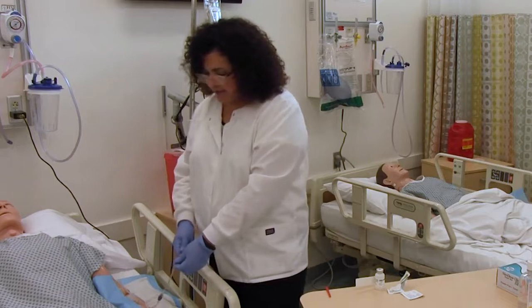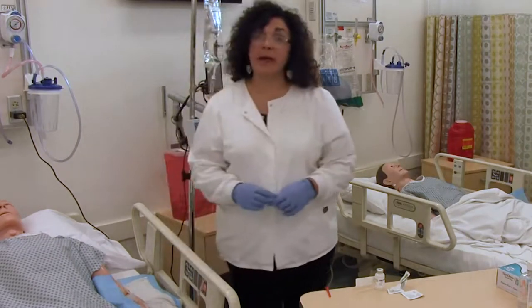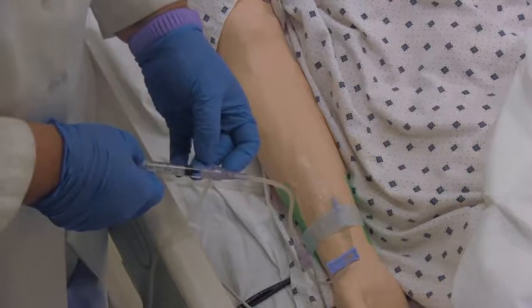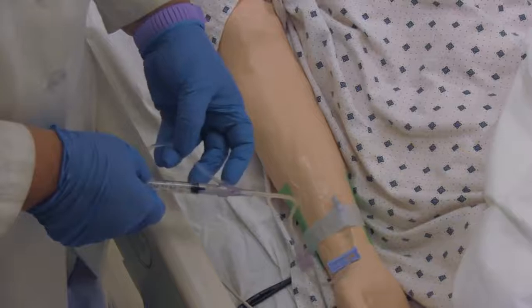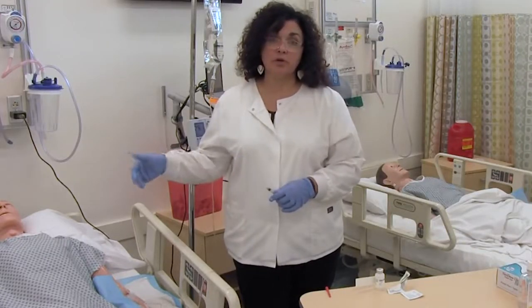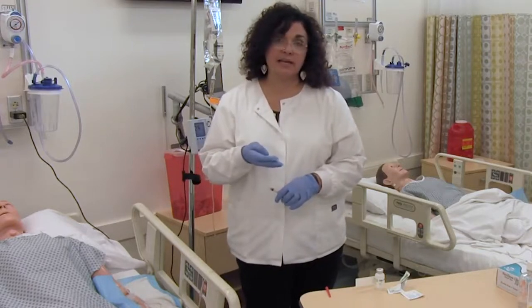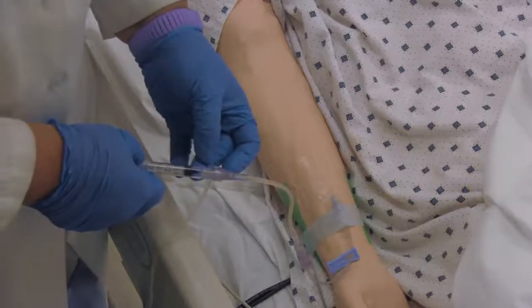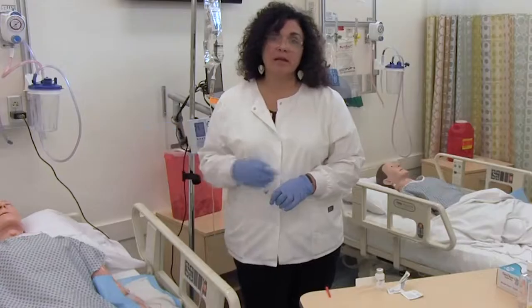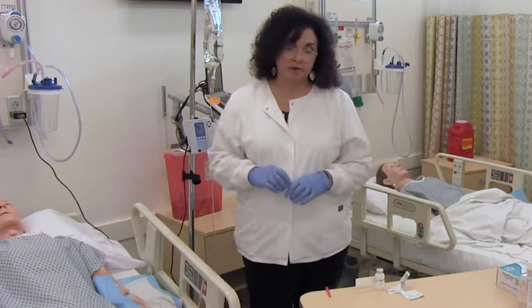And you'll notice there is a pattern. I'm going to pinch the tubing, push the incremental amount, release the tubing so that it starts to flow into the patient, and wait the balance of the 15 seconds. So pinch, push, release, pause. And we do that incrementally until the medication has been delivered.